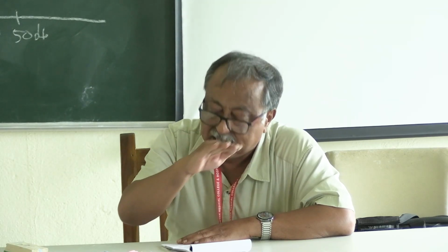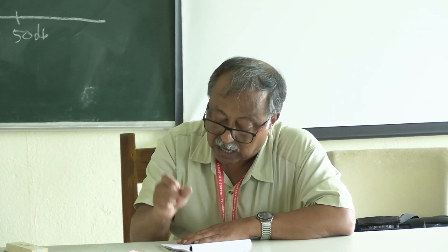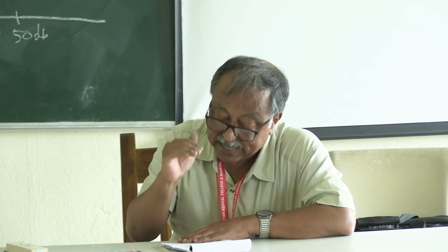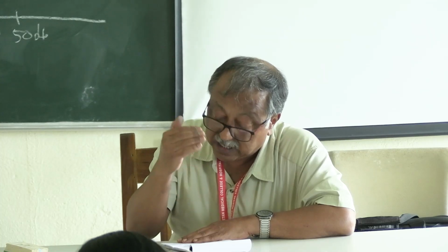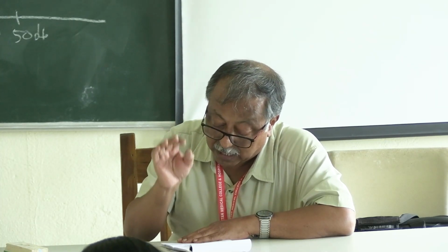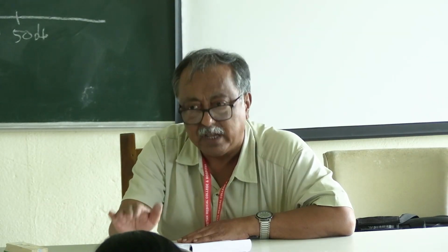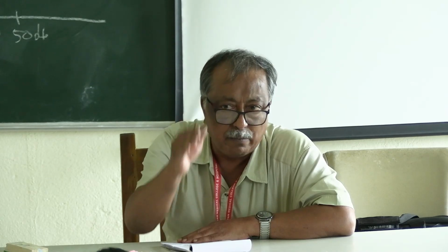That means a definite frequency, a definite intensity, a tone is given, 4000 Hertz, 5 decibel above the threshold for 60 seconds, and the intensity is increased after the decay, until it is heard for 60 seconds. You will see more intensity is required for the retrocochlear or neural pathology, because the decay is more in case of the neural pathology.